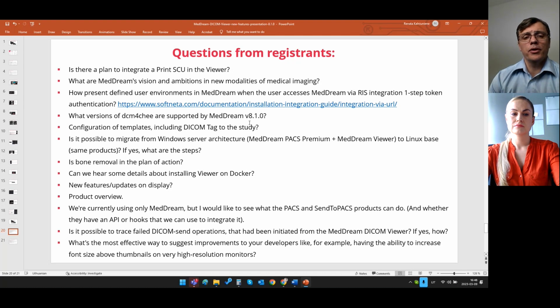But I really recommend reading all of this API functionality, because it is well described. It also contains some video. So this is really recommended, but you also need to count on this: even if you're missing some function, you just need to write us what you're missing, and we can always give you an exact estimate of the time in which you can get the missing feature.